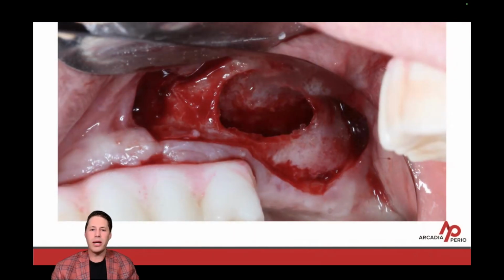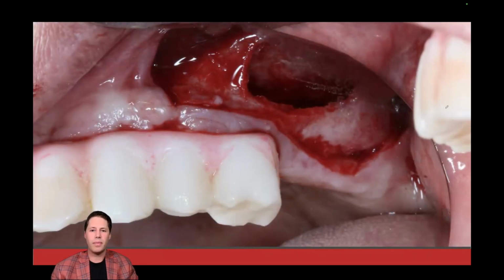So you can see here the intact sinus membrane, some minor bleeding. And what you'll do is you'll go in and you'll remove any of these sharp ledges with, again, the rotary instrumentation as you're placing your bone graft material. Again, just another view looking into the sinus. You'll see a surgical video here in just a second using a sinus curette, different from your other surgical curettes. They're more blunted, so they're softer around the edges of the instrument to help not perforate the sinus floor.